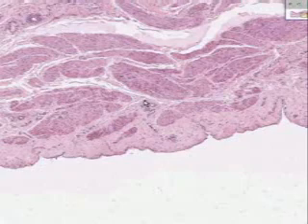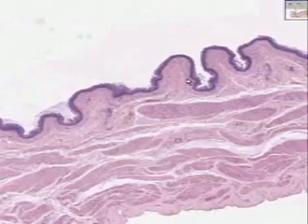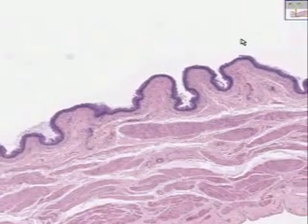Here's an artery, here's a vein, here's smooth muscle bundles, here's connective tissue of the serosa or adventitia, here's a vein, here's an artery, here's some more connective tissue. Notice that you may very well have a hard time differentiating the spindly fibroblasts of the connective tissue from the spindly nuclei of the actual smooth muscle bundles of the detrusor muscle. Also, I hope I can quickly zero in now on a classical transitional view of the epithelium itself.